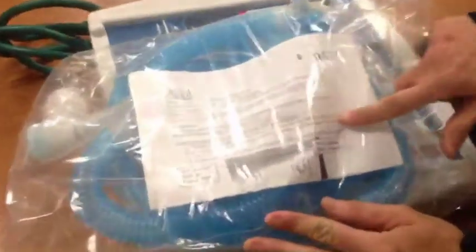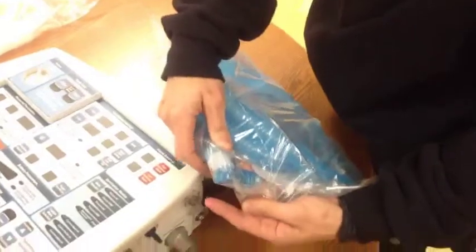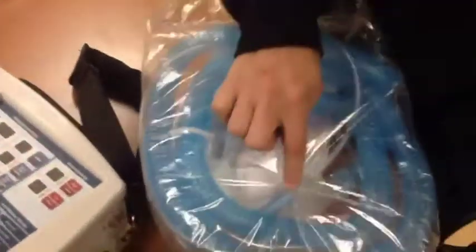The instructions are right here. Should you happen to run across a problem where you don't recall exactly how to hook it up, it's simple A, B, and C instructions for you. When you open up one of these circuits, for purposes of demonstration, I'm going to leave it intact in the bag, but like other circuits, you have your adapter for your endotracheal tube or for your trach tube, and then you have the adapter for the patient circuit going into the device itself. The blue connector will always go to the exhalation valve located on the side here. But don't sweat it. Instructions are in the package, so you always have that reference.